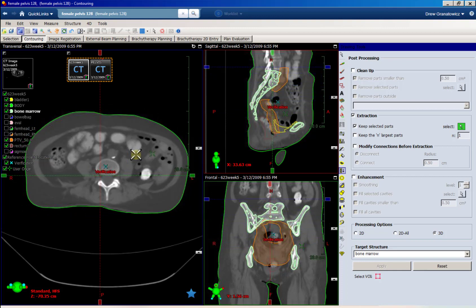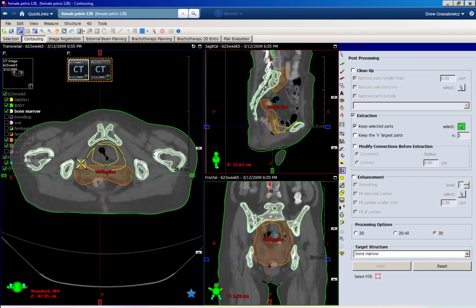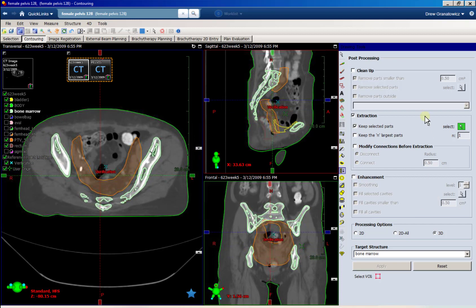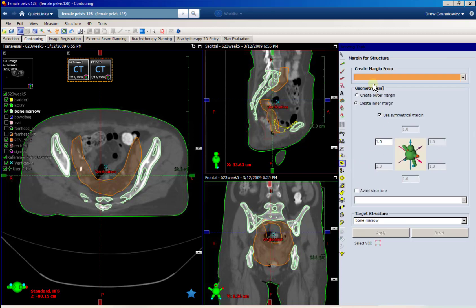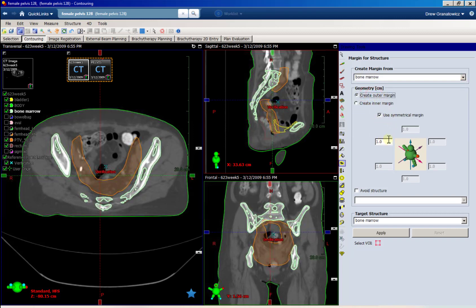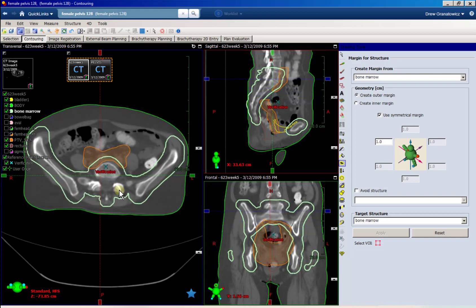None of that bowel was connected, so it got rid of all that bowel and now we're just left with our bones. But we still want to get rid of all these holes in the bone. You could play with the post-processing settings to do it, and I'm pretty confident there's a way. But I think it's easier to do it a different way — I come to the margin tool and expand my structure by one centimeter. That basically expands into those holes and gets rid of them.